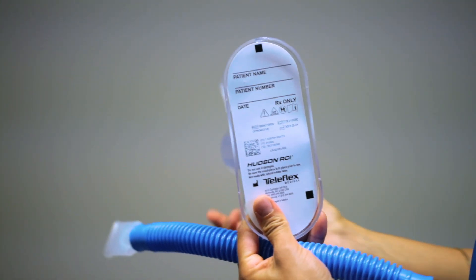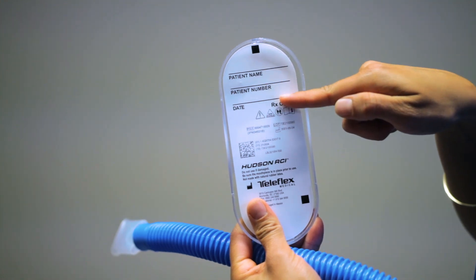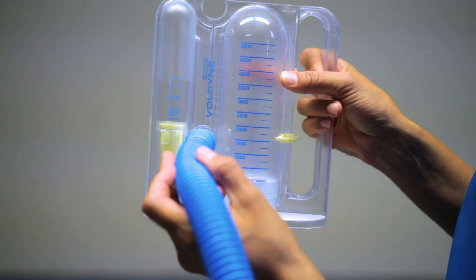An IS is not to be shared amongst patients and is individual to each patient. At the bottom of the incentive spirometer, you can write your patient's name, room number, and date. The IS comes with a mouthpiece that has flexible tubing that you can attach to the front part of the IS.